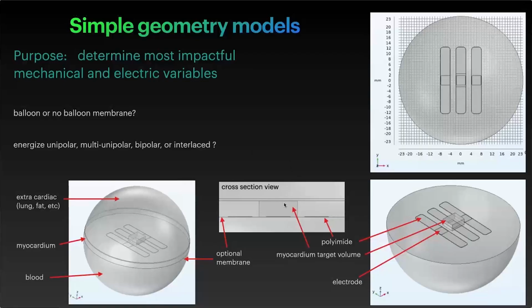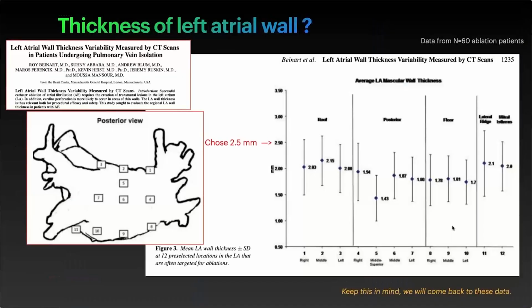We have a target centered on the central electrode here. It's 5 millimeters wide, and it's what we're trying to do, and it's as high as the myocardium, as you see here. And what we're trying to do is measure how much of that target is filled, so to speak, with 600 volts per centimeter of magnitude electric field, which is a requirement of electroporation.